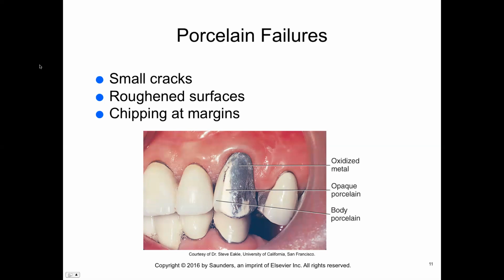Avoid acid etchants and acid fluorides on ceramic restorations, as these will roughen the surface of the ceramic. The porcelain surface, once it's been fused under temperature, is very hard and smooth. All of the glass-based ceramic materials should be bonded to the tooth with a resin cement. When porcelain restorations are delivered, they often must be adjusted to ensure the fit. These adjustments remove the glaze from the finish. These restorations may be returned to the lab to be reglazed before cementing.